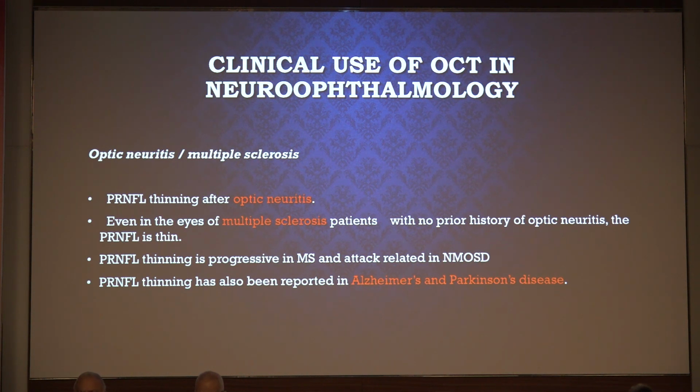Whereas if a patient has NMO spectrum disorder, the patient gets an attack of optic neuritis and there is a thinning.